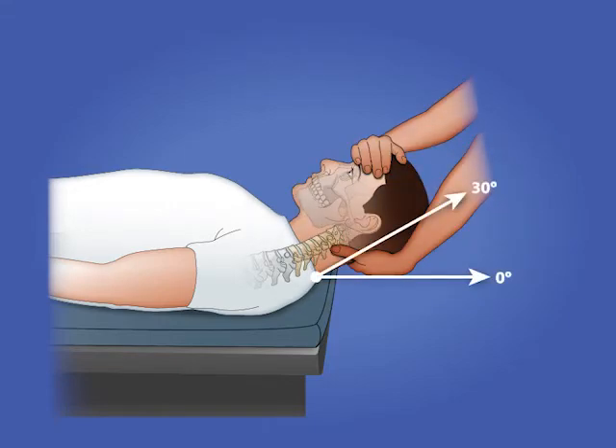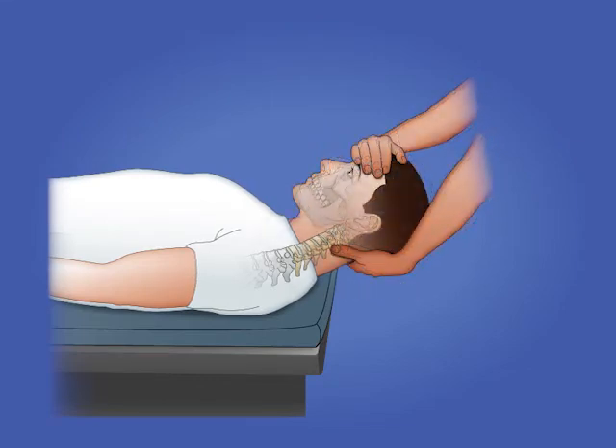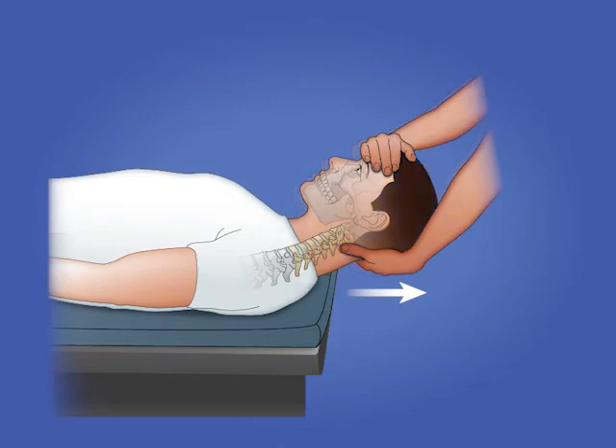Separation in the cervical vertebrae has effects on the intervertebral disc, facet joints, and cervical musculature. As seen here in the angle of pull, tension applied opens the intervertebral foramen and reduces the amount of pressure on the nerve roots and disc.